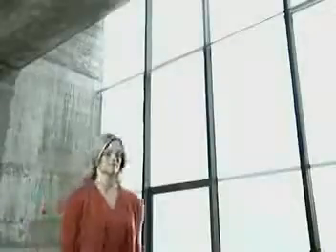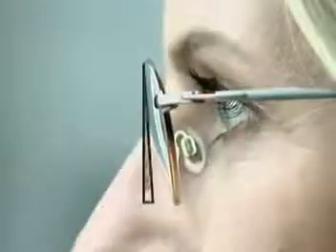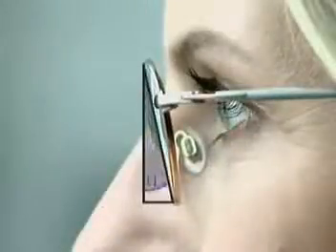Ask the patient to move around a little in order to relax their body posture again. Now mark the vision point in the lens with the eyes looking straight ahead in this natural body posture. This also marks the glazing height. Measure the distance between these 2 points and note the value in millimeters. Rodenstock will use this value to calculate the angle of pantascopic tilt for you.